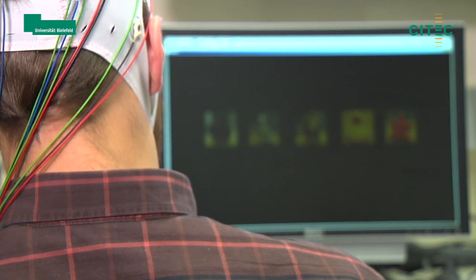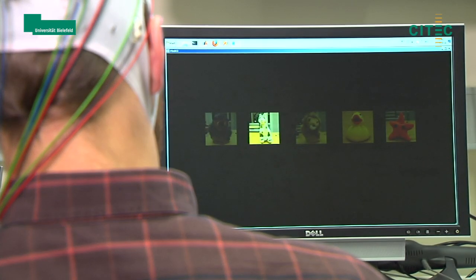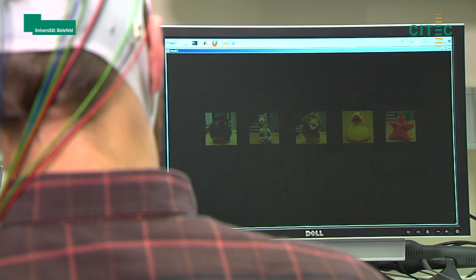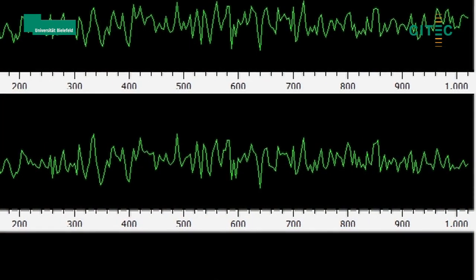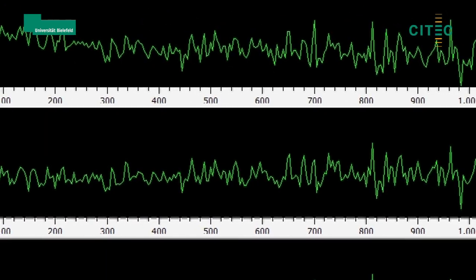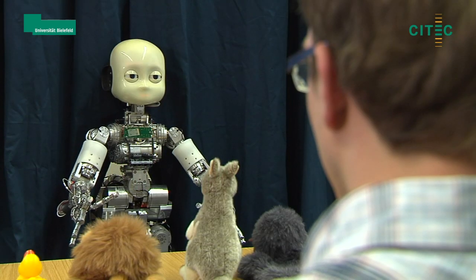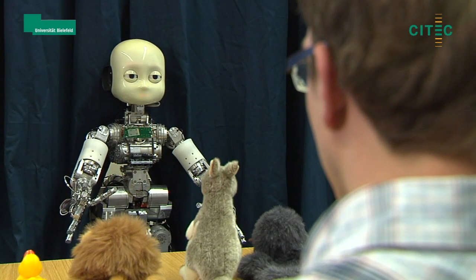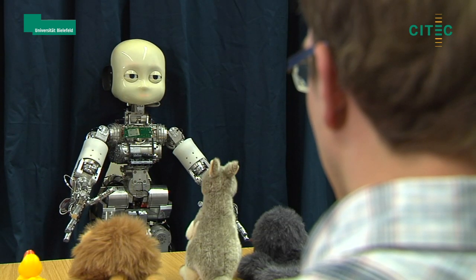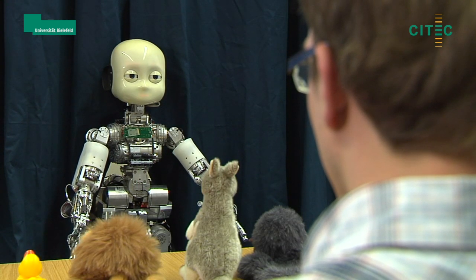Five different toys are arranged in front of iCup on a table. While the handicapped person concentrates on a specific toy displayed on the screen, the EEG shows a distinctive pattern called P300. This pattern can be clearly identified and used for the selection.